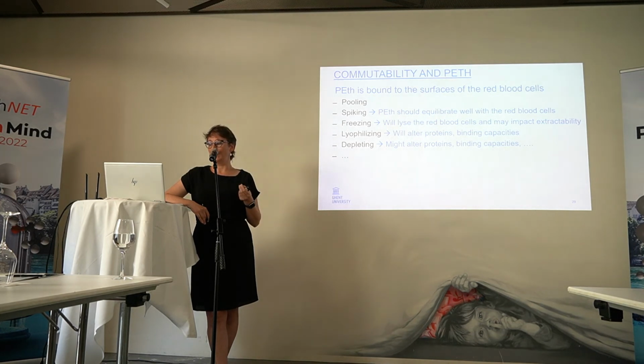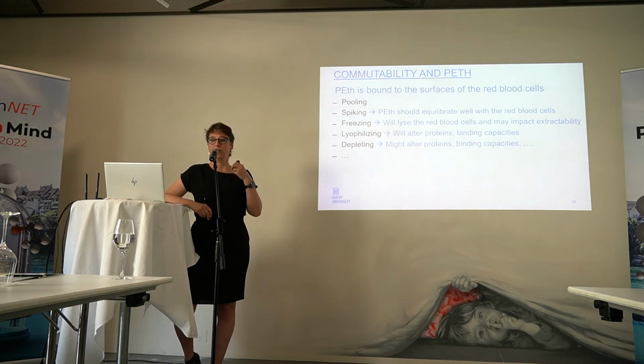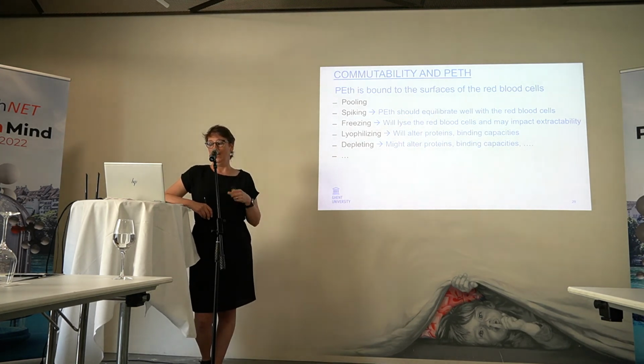Freezing will lyse the red blood cells, and it may impact, for example, extractability. It might be possible that for a lysed blood sample which you apply afterwards to a DBS or another dried sample, the extractability will be different than for the native, non-lysed blood sample. The same with lyophilizing and depleting samples: it will alter the protein binding, it will alter the binding capacities, it will do so many things to a sample which involve a risk for what you want to do afterwards.